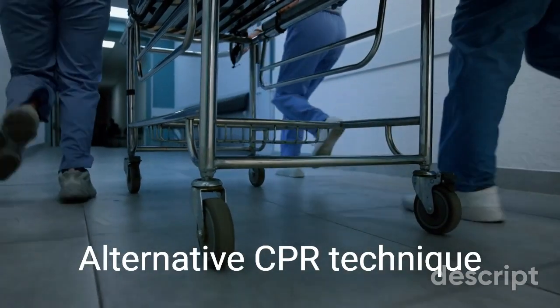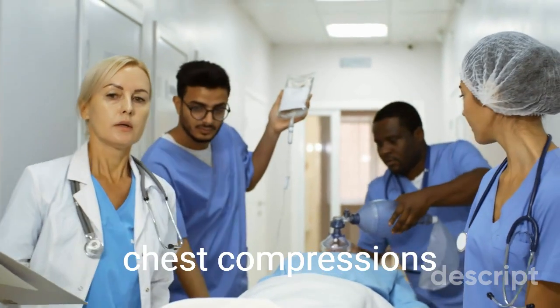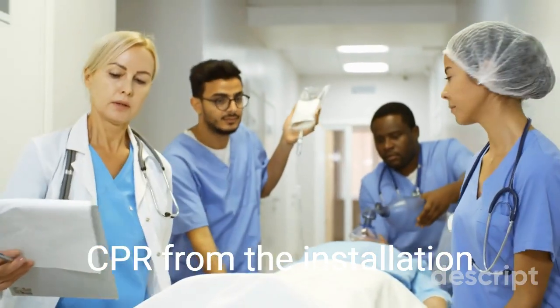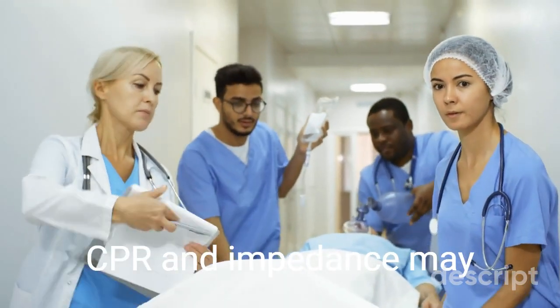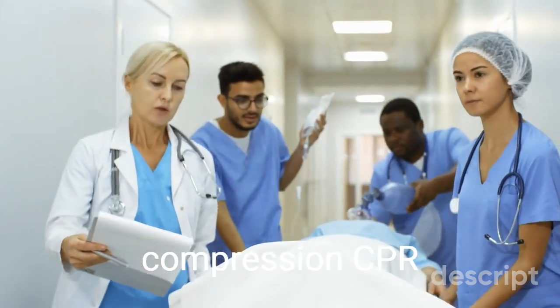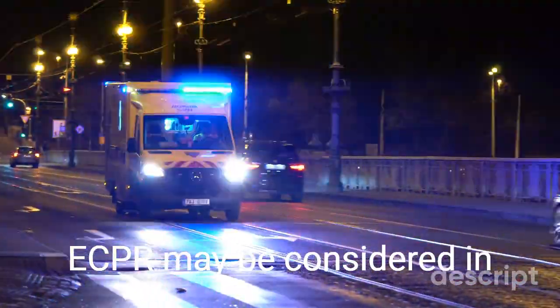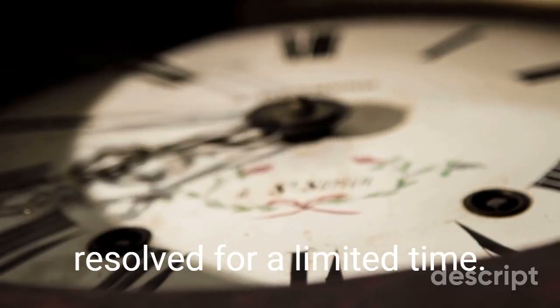Alternative CPR techniques. A mechanical CPR device is considered for use in situations where manual chest compressions are not effective. Minimize interference with CPR from installation to the start of using the device. Active compression-decompression CPR and impedance devices may be used if equipment and trained personnel are available. Interposed abdominal compression CPR may be considered if adequately trained personnel are available. Extracorporeal CPR: ECPR may be considered in cases where cardiac arrest is due to a cause that can be resolved for a limited time.